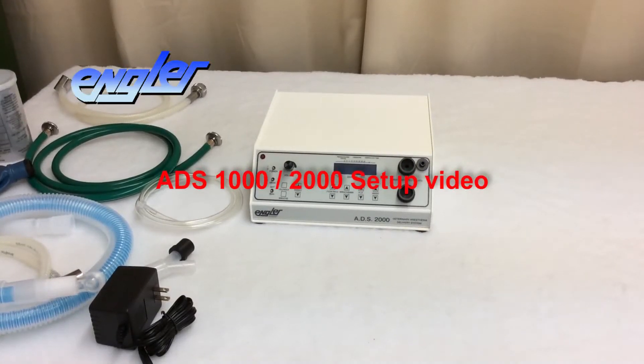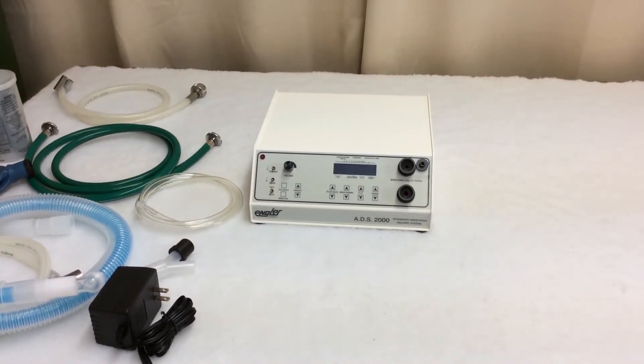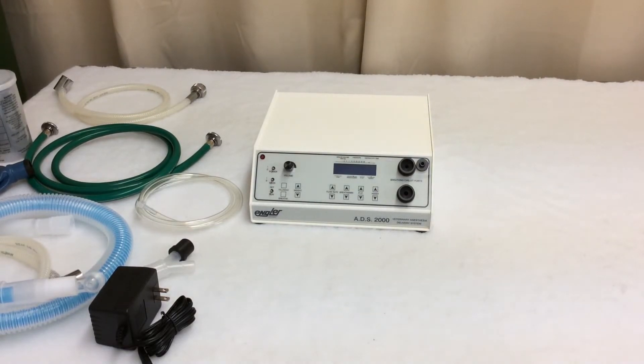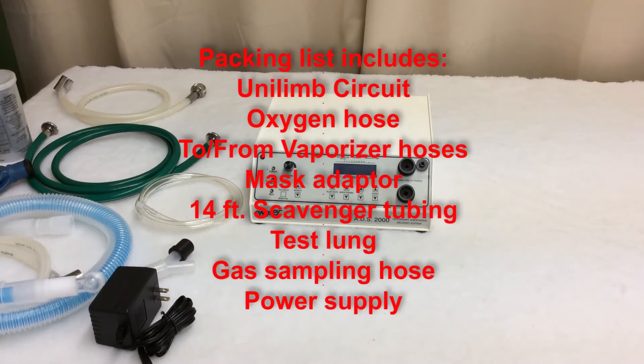In this video, I'm going to describe some new features that we've added to the ADS-2000. Specifically, the blue backlit display and the gas sampling hose. But before I get into all that, I want to show you what you should expect to find in the box when you first get your ADS-2000.